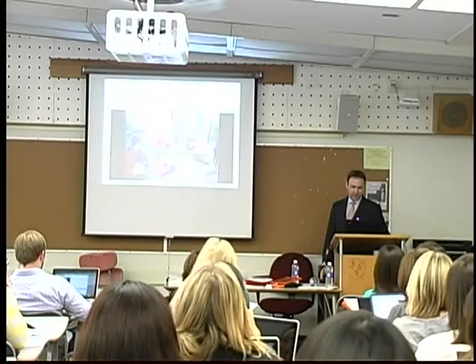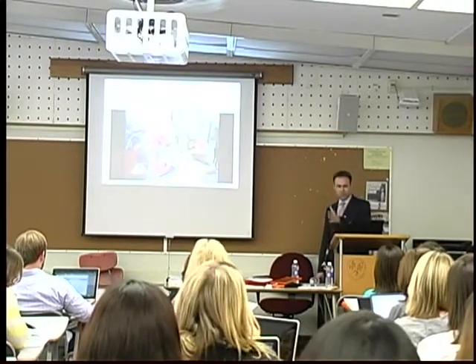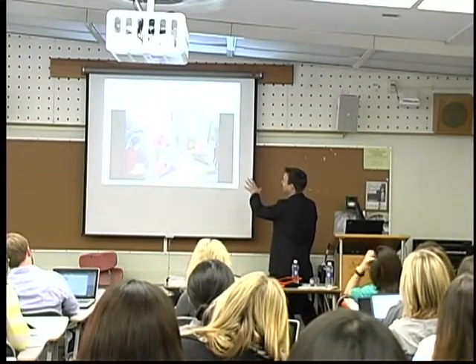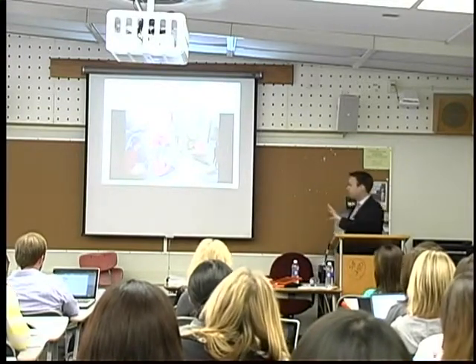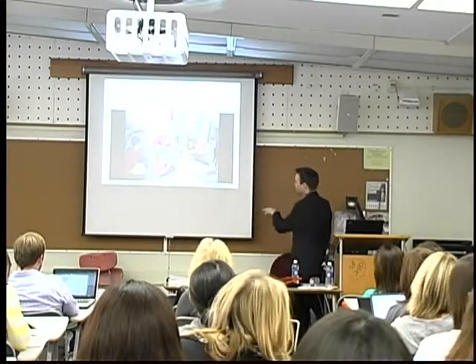Okay, and here is 6 or 8 weeks after we've stopped that. We're doing another generalization probe, requesting, but without the iPad. And this is her sister. Her twin sister is present there. Her twin sister has no autism at all. And now we're trying to get her to request for her favorite toys again.